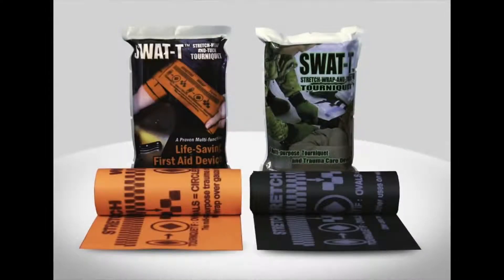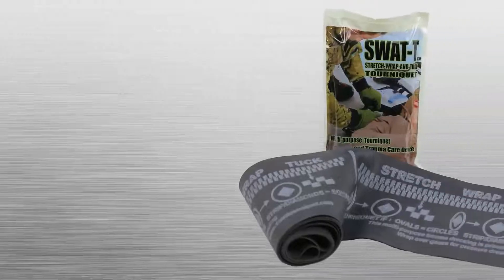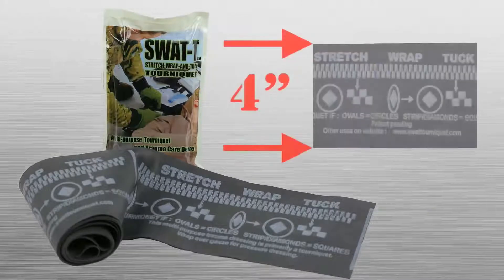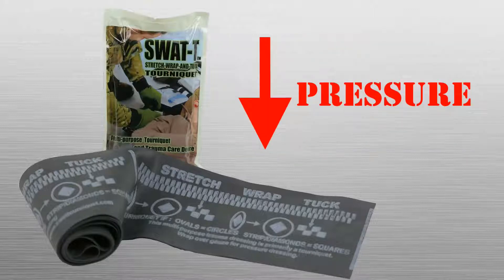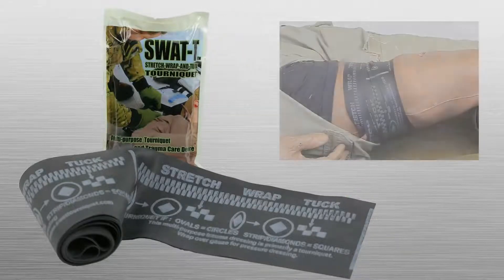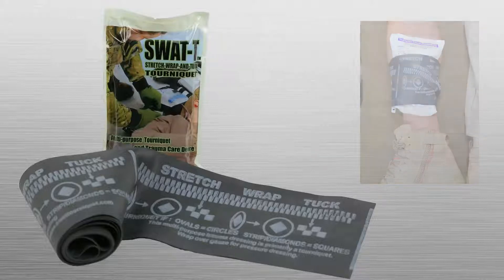The SWAT-T Stretch Wrap and Tuck Tourniquet from TIMS Solutions is a unique multipurpose medical device. The wide elastic band construction has been clinically shown to function effectively at lower pressures than traditional windlass style tourniquets, meaning less potential for injury and less pain. The SWAT-T's unique design allows it to serve as a tourniquet, pressure dressing, and elastic wrap, among numerous other potential uses.